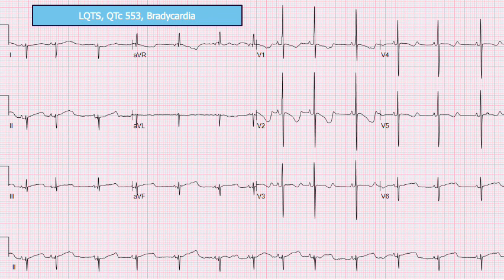I put up this slide just to highlight what a really abnormal ECG would look like in a baby that does have long QT syndrome. This is actually a patient of mine who has long QT2 and whose mom also has long QT syndrome. And this baby, this is actually day of life 0 ECG. And I think there are two really striking things about this ECG when you look at it.